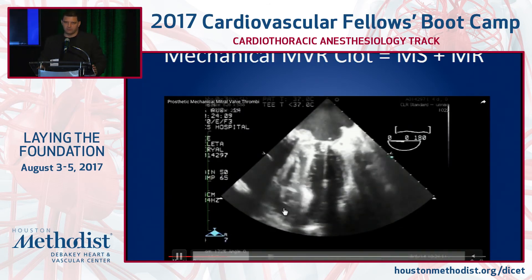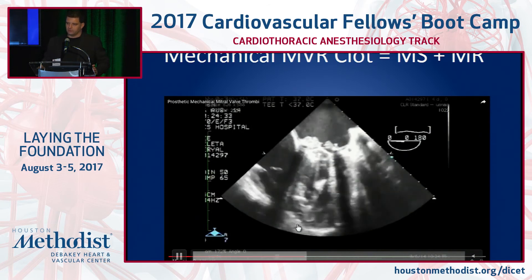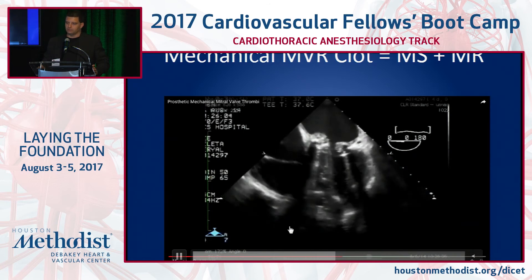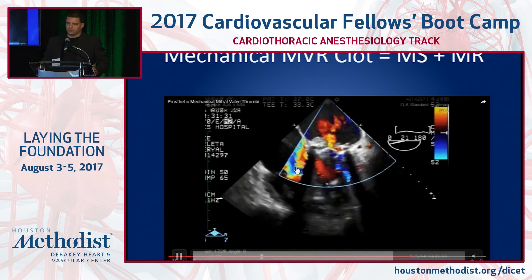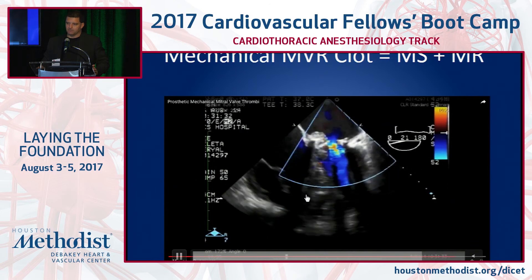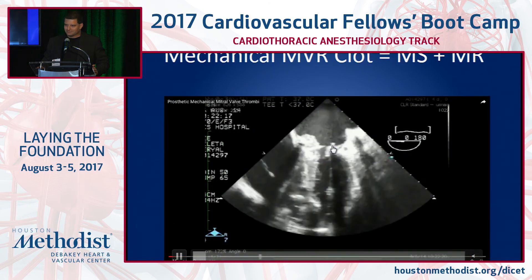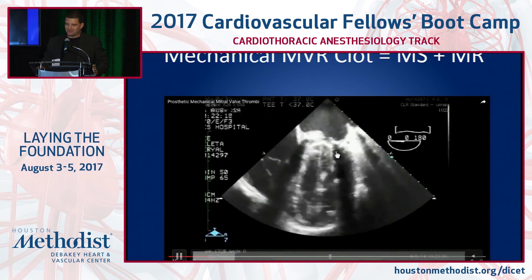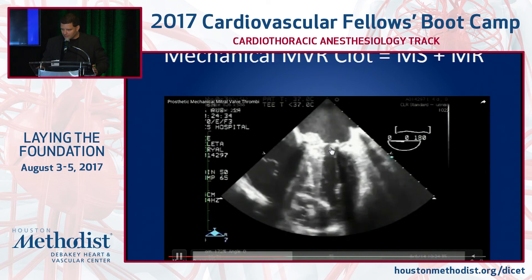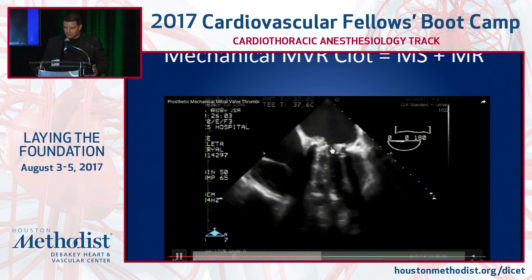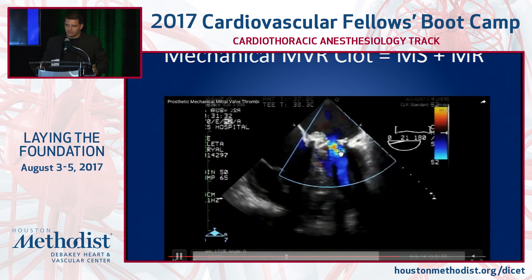Iatrogenic: people get mitral valve replacements all the time. Mechanical valves require lifetime anticoagulation, which is sometimes very difficult to achieve on an outpatient basis. Some patients are more compliant than others — this one wasn't. You can see the mechanical valve moving right here in the middle, with a nice big clot blocking one of the leaflets, and another smaller clot right there, causing both mitral regurgitation and mitral stenosis.